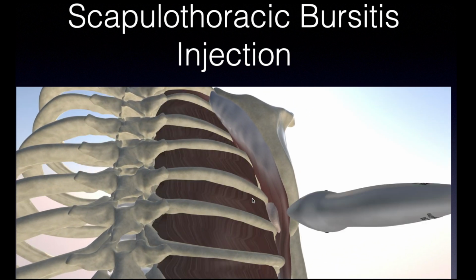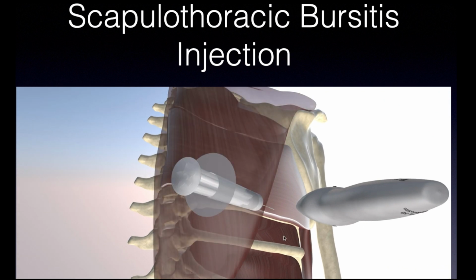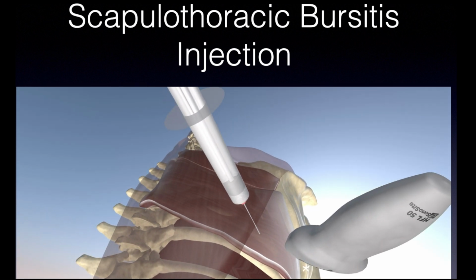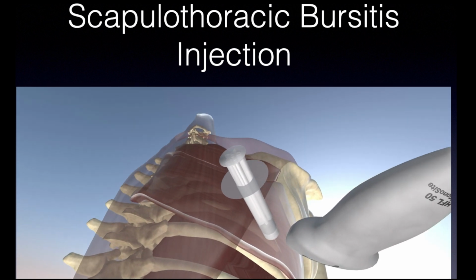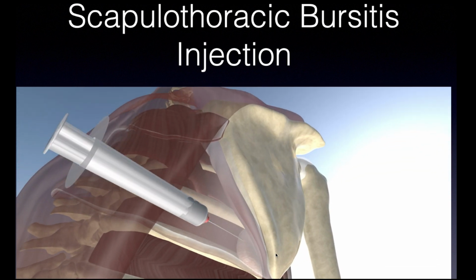It's really hard to decipher the external intercostal muscles. And you always want to keep your needle tip in view, because you don't want to give the patient a pneumothorax. That's why I think a lot of people shy away from this procedure, including myself. I'm not in a rush to do this at all. And here's the procedure done.